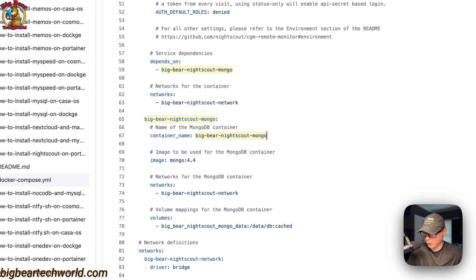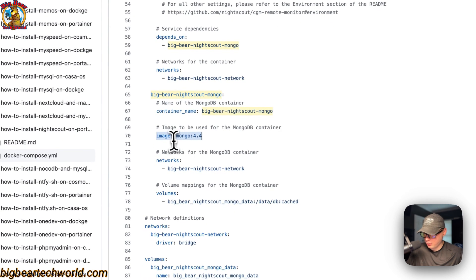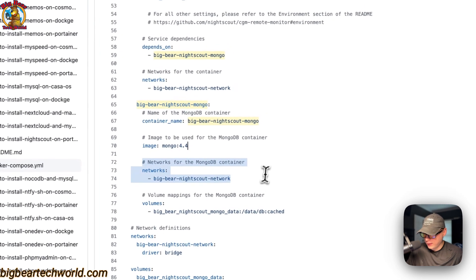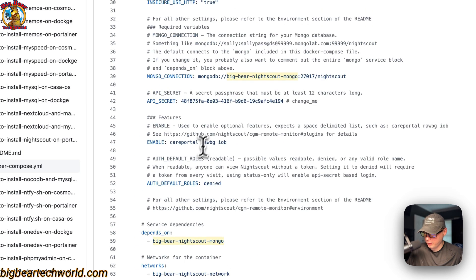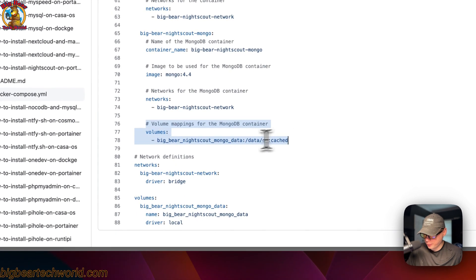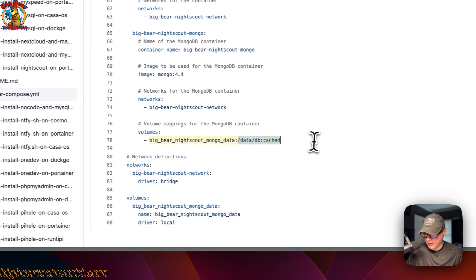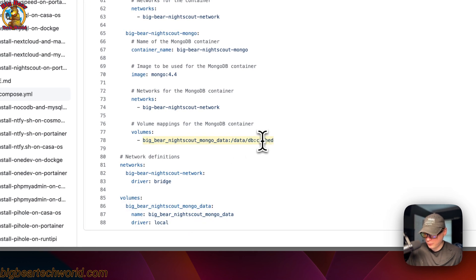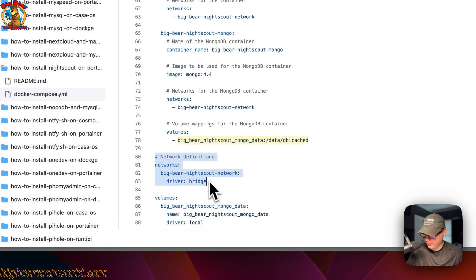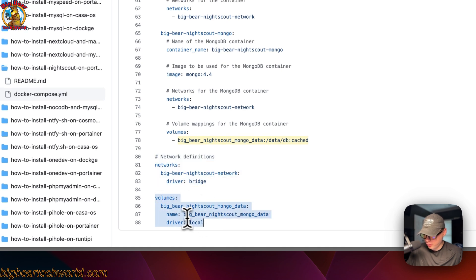The second service is 'big-bear-nightscout-mongo' with container name 'big-bear-nightscout-mongo'. The image is 'mongo' from Docker Hub, using tag 4.0.4. It's placed in the same network so we can connect using the service name. The volume 'big-bear-nightscout-mongo-data' is a local volume, mounted to '/data/db' on the container side with caching. The network is defined as a bridge network.